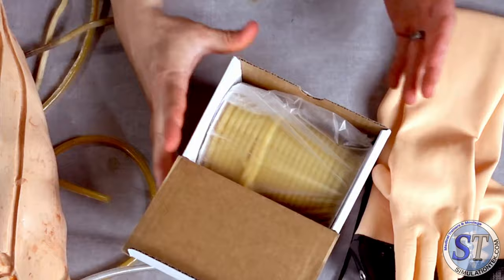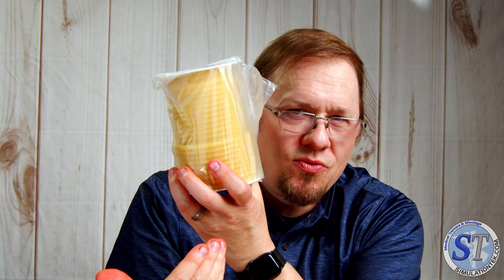This is a whole spool of surgical tubing. Notice it's wrapped in plastic. You always want to wrap these in plastic, Ziplocs, whatever, because the longer it's exposed to outside air, it's going to dry rot and be trash. I've had tubes of these where we say, oh, we're going to put it in bags sometimes, it gets jammed in a drawer, and then we pull it out a year later, and it's trash.